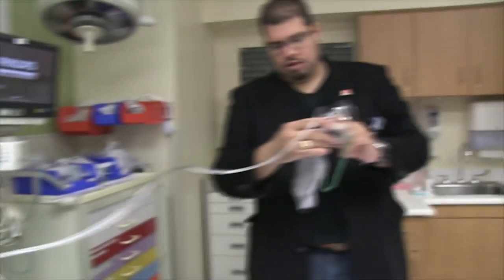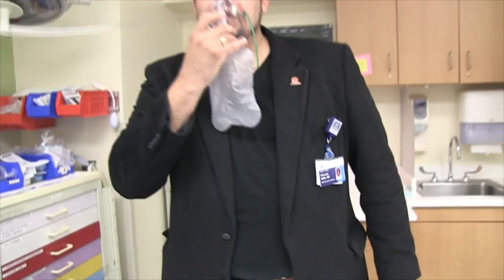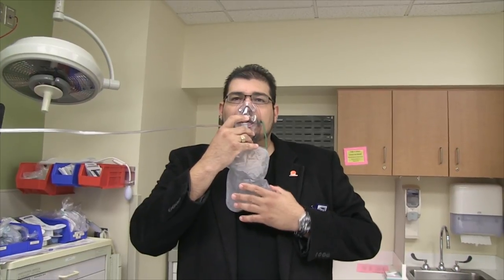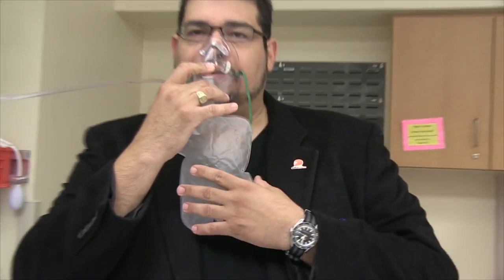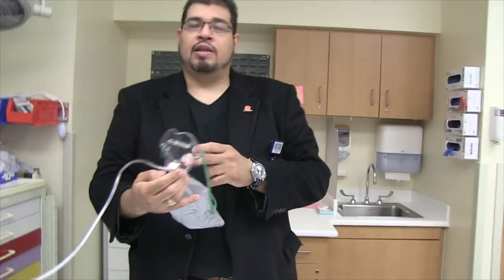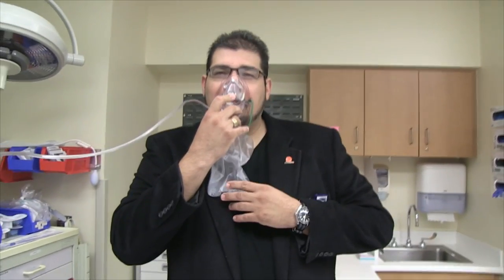Okay, and so I'm going to fill up the reservoir, right? And so, at a normal rate of breathing, I take a breath, and I collapse the bag a little bit, but the bag is always inflated, so there's always a reservoir of high concentrations of oxygen inside the bag and the mask. However, what can happen is I can overwhelm this, right? Okay, overwhelm it. Go ahead. Look at that.